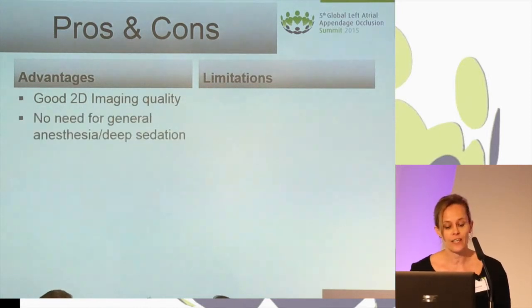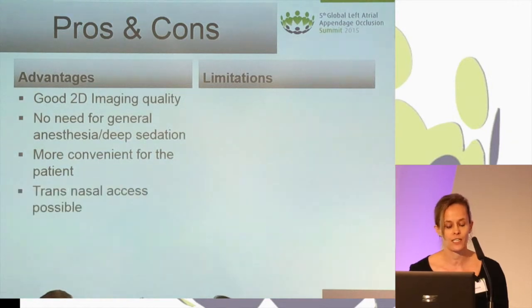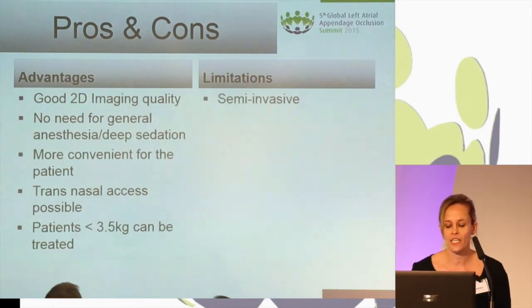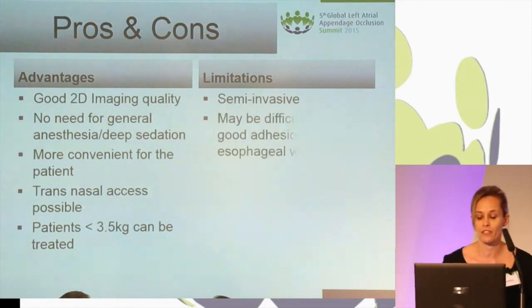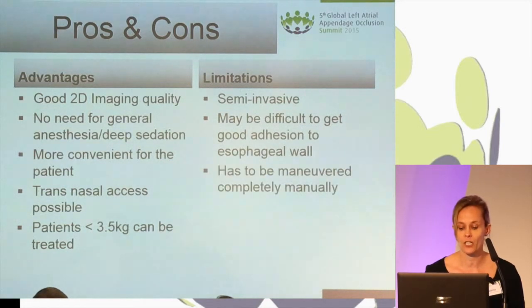The advantage is that we don't need general anesthesia or deep sedation for the patient. Therefore, it's more convenient for the patient. We can go for a transnasal access with this probe. It's possible, and we can treat patients who are really small. On the other hand, we have to keep in mind that it's still a semi-invasive investigation. It may be difficult with this very small probe to get good adhesion to the esophageal wall, so it might happen that we have less good imaging quality.